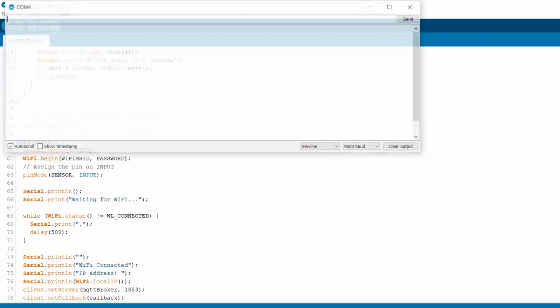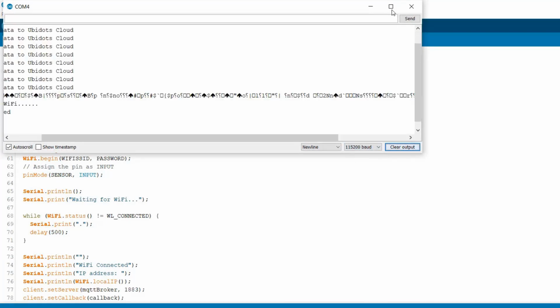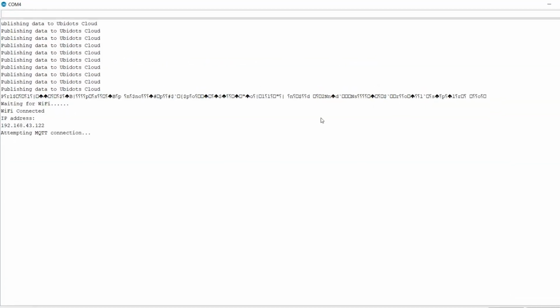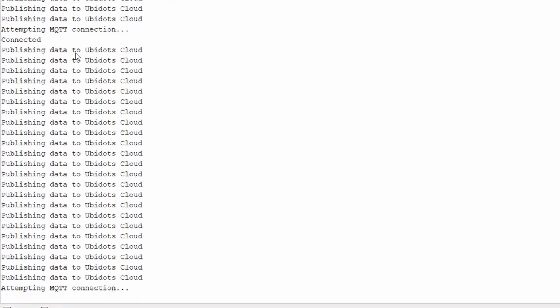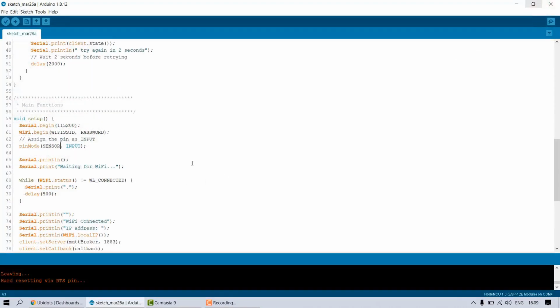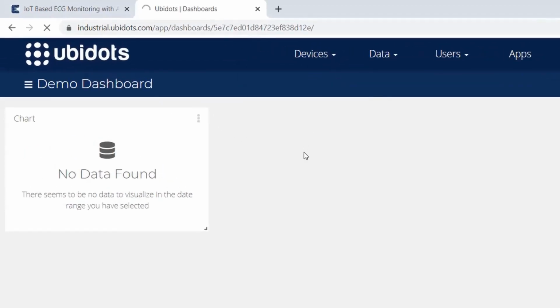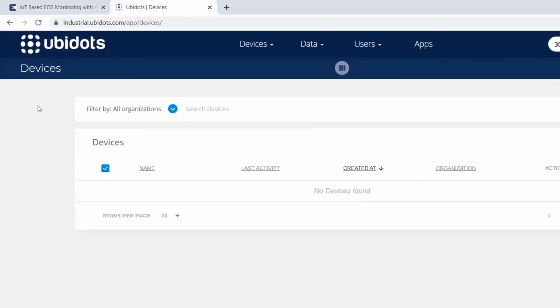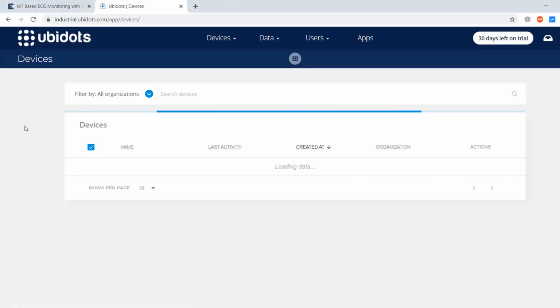So once the code is uploaded, you can open the serial monitor and set the baud rate to 115200. It will start connecting to Wi-Fi and it will print the IP address and it will immediately establish the MQTT connection and it will be publishing the data to the Ubidots cloud. So go to Ubidots, click on devices. Now after clicking here, nothing is displayed. So what you do is just insert your USB cable into the computer port. So once you insert it, just refresh this.